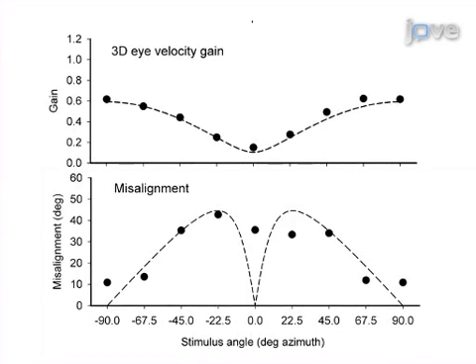This technique enables us to test the vestibular system in all 3 dimensions. This is a main advantage over existing methods such as single-axis rotating chairs that are used in ENT clinics. This method provides insight in 3D vestibular function in healthy subjects. In addition, the method is used to study vestibular diseases such as schwannoma tumors, vestibular neuritis and Meniere's disease.